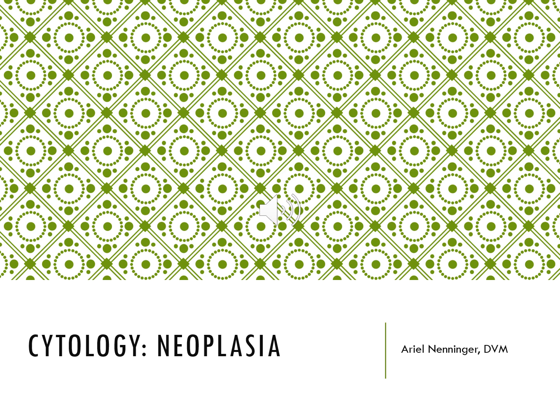We're essentially just going to be scratching the surface of neoplasia cytology. It's really hard to cover everything you guys will need to know in 50 minutes. I spend 3 to 5 years of residency learning it. So this is just to help you guys in practice with some of the major cytologies and neoplasias that we see.